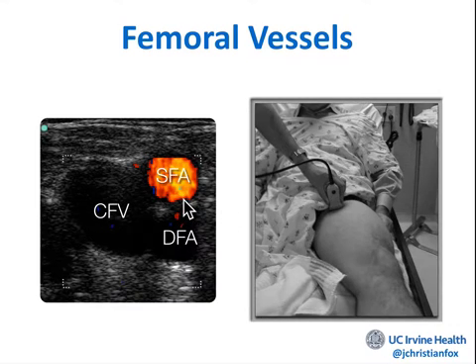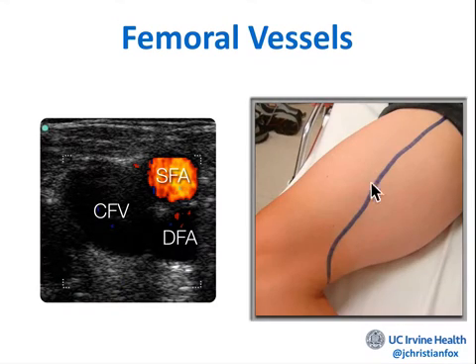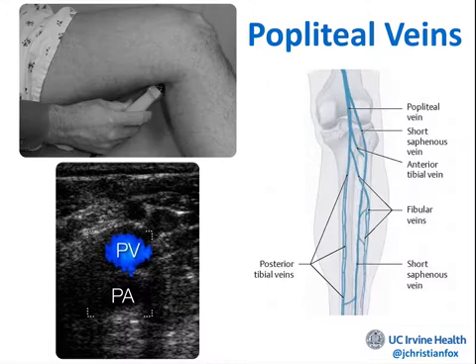So which leg is this? If venous rhymes with penis, and the indicator is to the patient's right, this must be the what leg? Good, the left leg. So, common femoral vein, superficial and deep femoral arteries here, and you're going to start making your compressions. Again, you're going to go all the way down the leg through that superficial femoral canal until you get to the popliteal area.